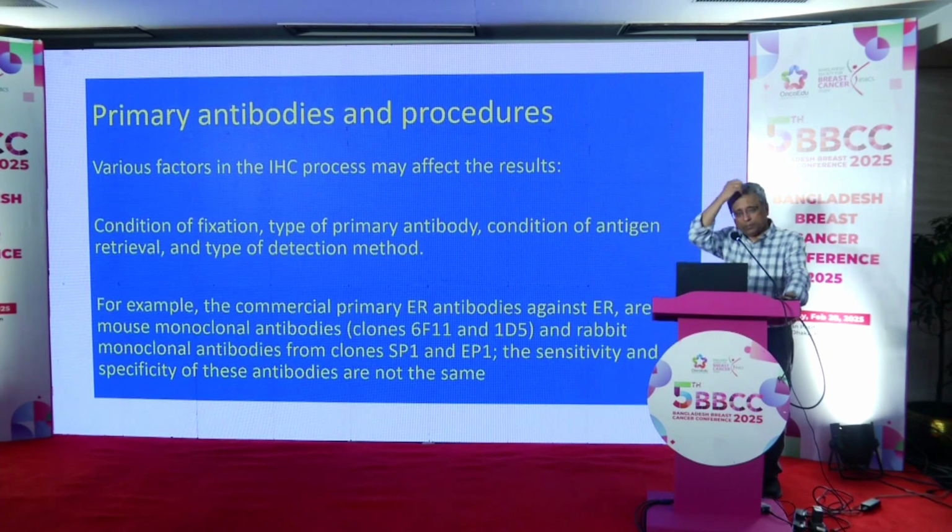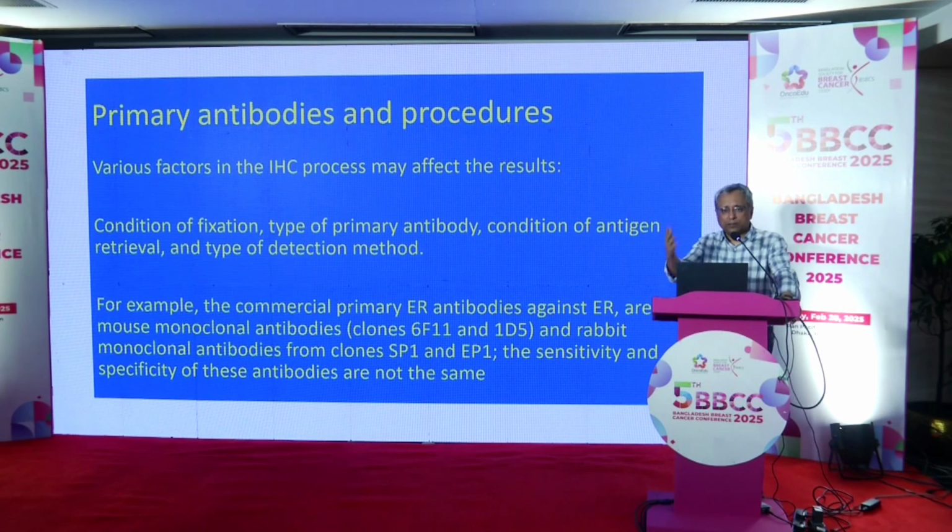Okay, so that was about tissue. Then the next thing is the use of antibodies. So when you decide to use antibodies, say you want to use ER, now ER has so many clones in the market. Which clone do you choose? Right? So that's also critical.